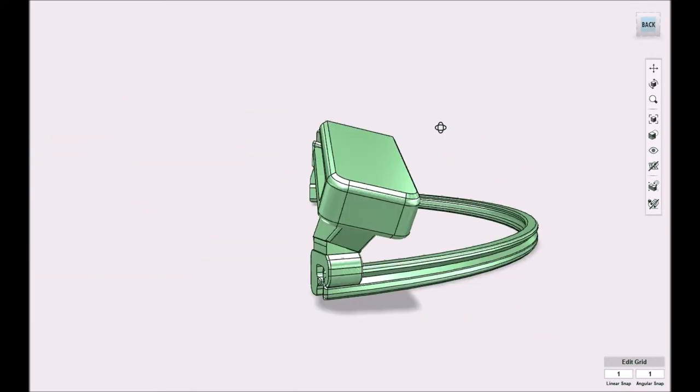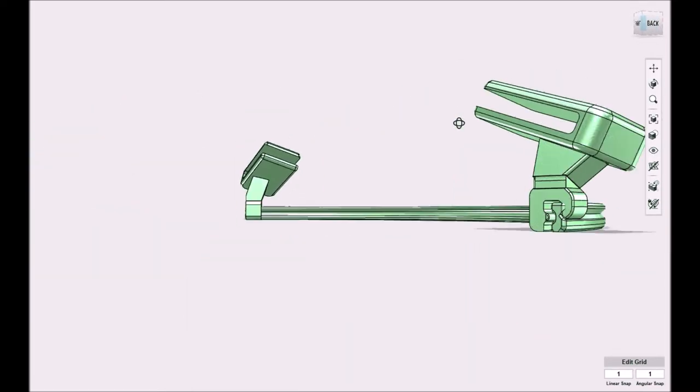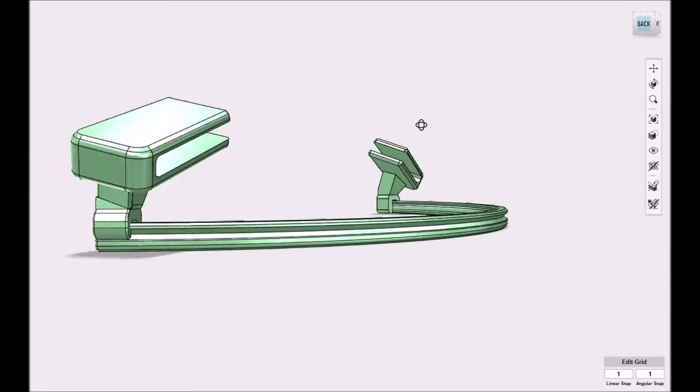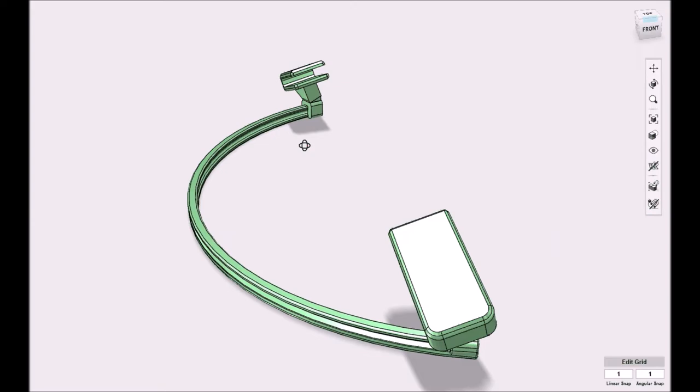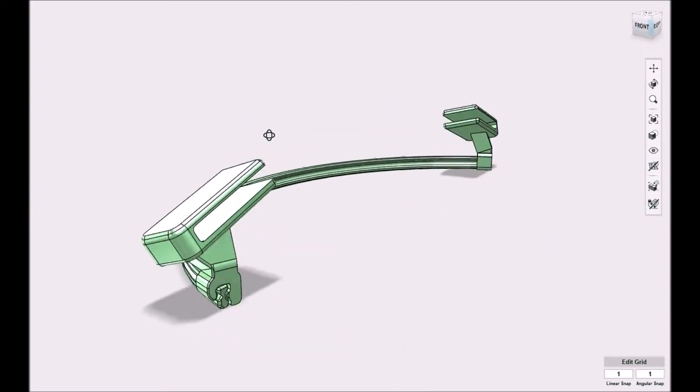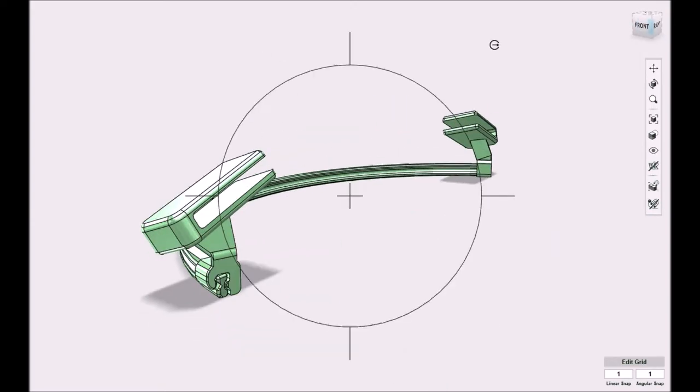The whole assembly is very lightweight and it takes about 10 minutes to print each part. The little clips take one minute each.